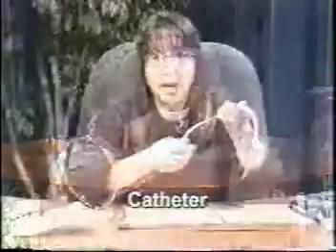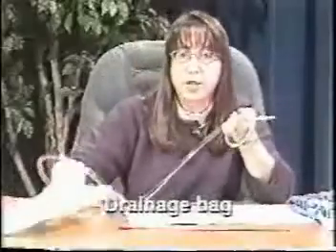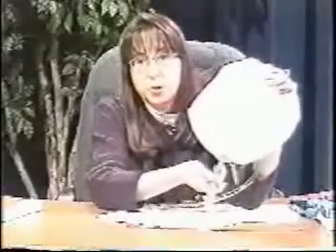The other urinary drainage equipment that you need to be acquainted with for continuous urinary drainage is, here's the catheter we discussed, and it is connected to tubing and a drainage bag. This tubing is clear, so you can observe and report any characteristics of the urine. This will hang on the bed frame, and it has a little spout here that can be used to drain the urine.